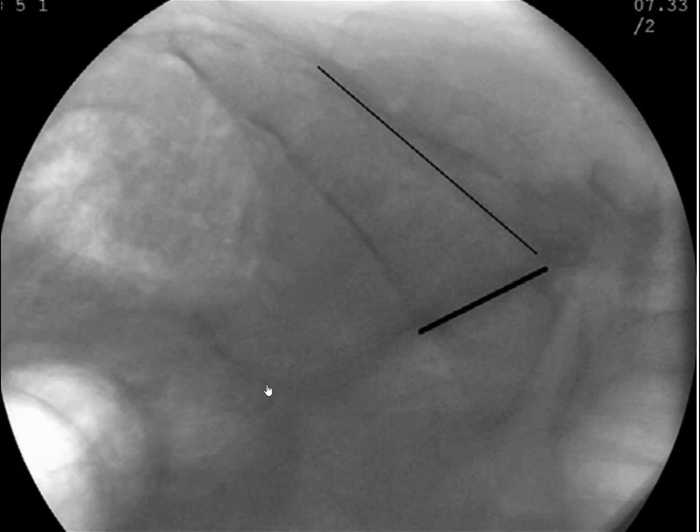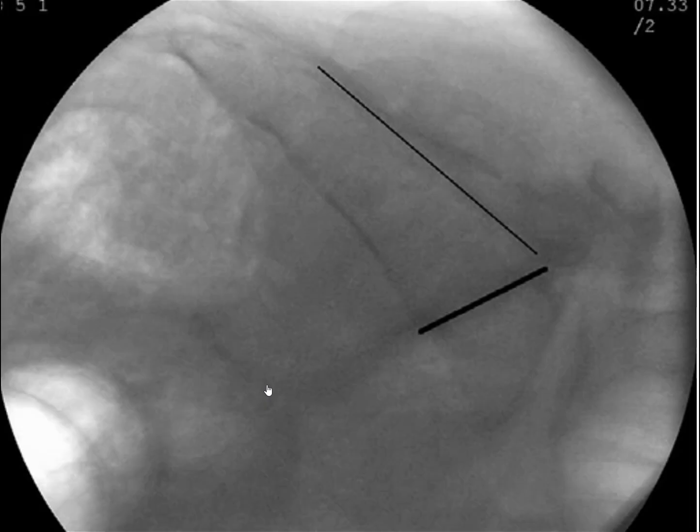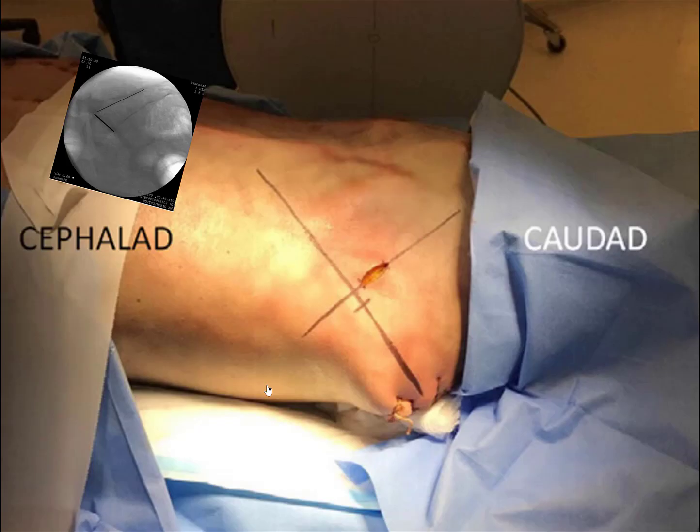But it makes sense because you're supposed to have bone going through the implant right at the articulation. That's why it has that hole there. So you have a place versus just a solid screw. You're providing a pathway of fusion across the joint through the implant. I mean, it's a small hole though. Yeah.